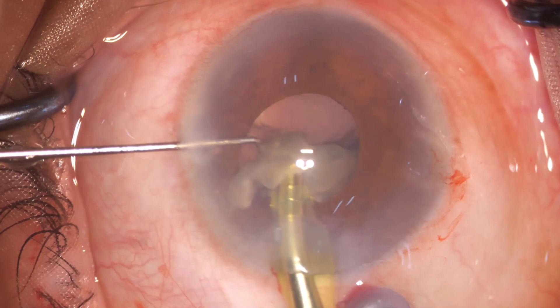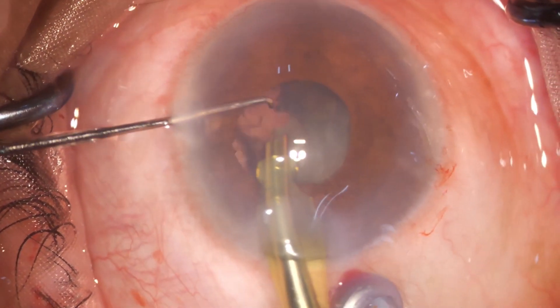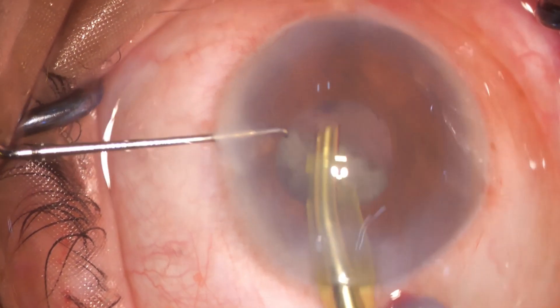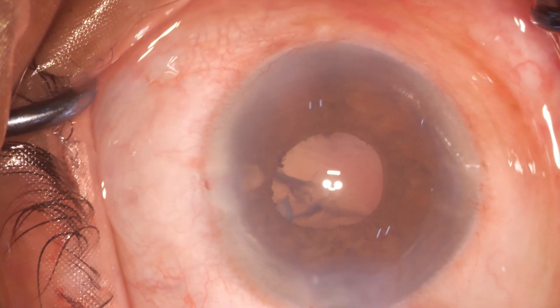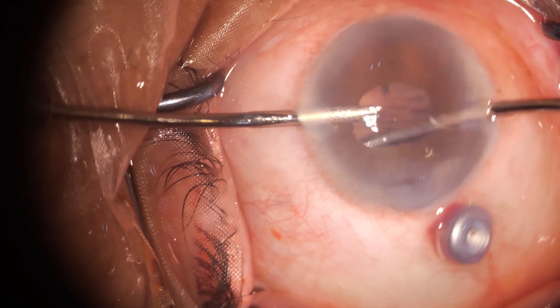One has to carefully keep the probe right at the level of the iris — not below, not too high — as the space is just 1.6 millimeters. Most of the cortex is out.